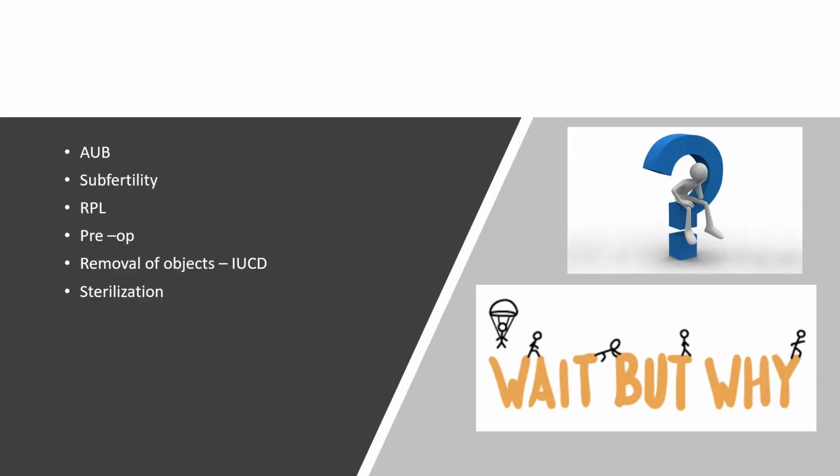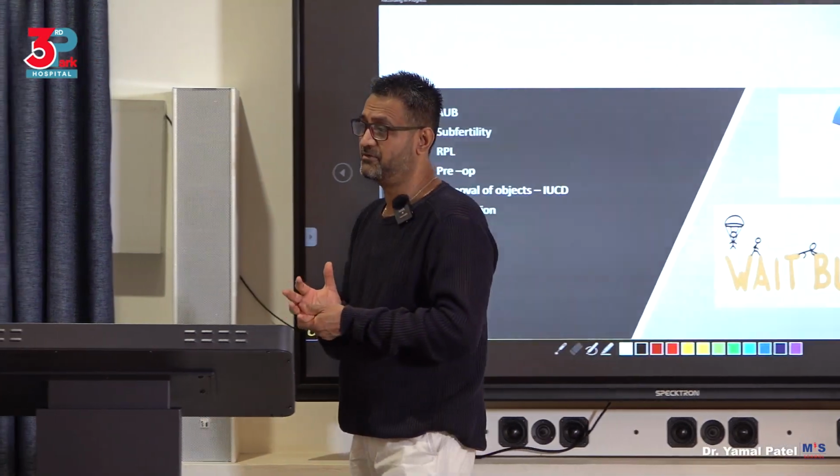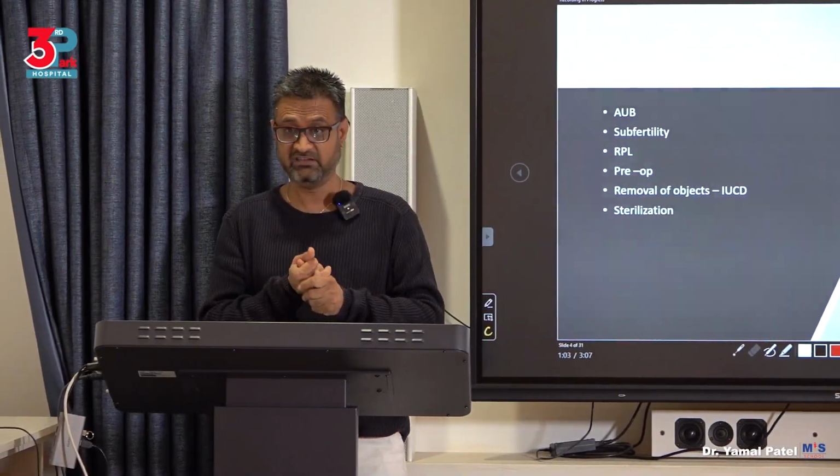It could be preoperatively as well. When we are doing, let's say, myomectomies, I always do a diagnostic hysteroscopy to see if there are any cavity issues before we proceed and go and do the operative myomectomy laparoscopically.